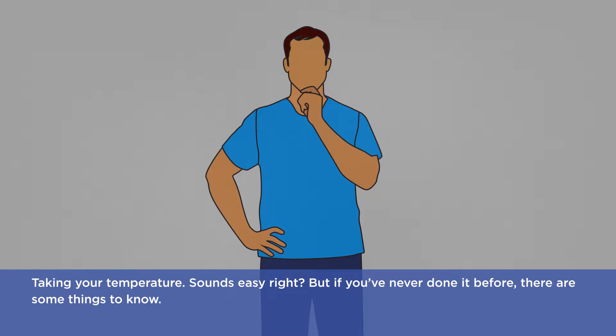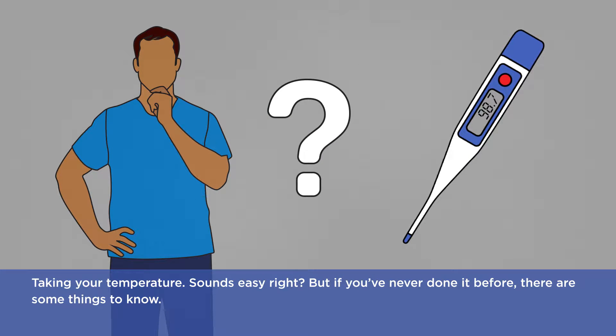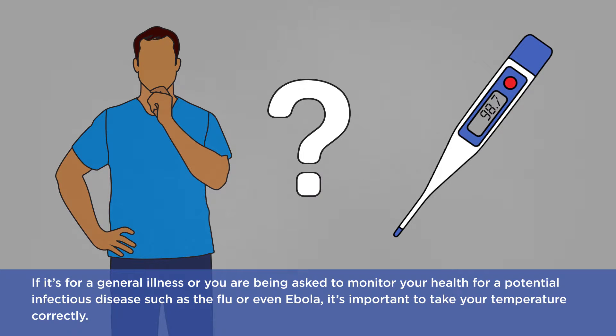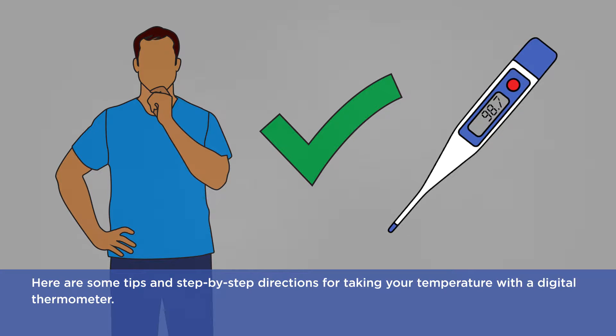Taking your temperature sounds easy, right? But if you've never done it before, there are some things to know. If it's for a general illness or you are being asked to monitor your health for a potential infectious disease such as the flu or even Ebola, it's important to take your temperature correctly. Here are some tips and step-by-step directions for taking your temperature with a digital thermometer.